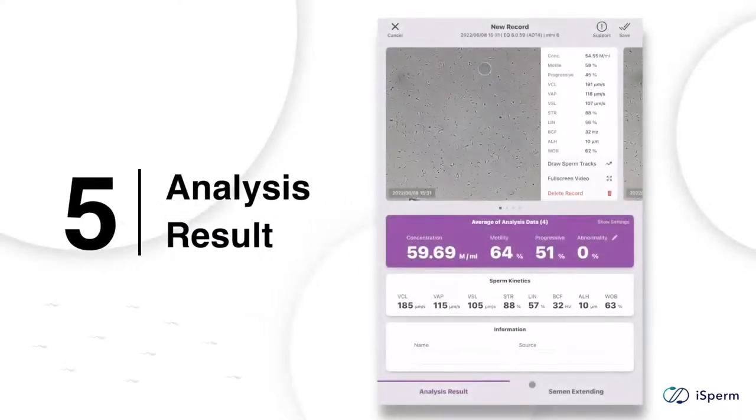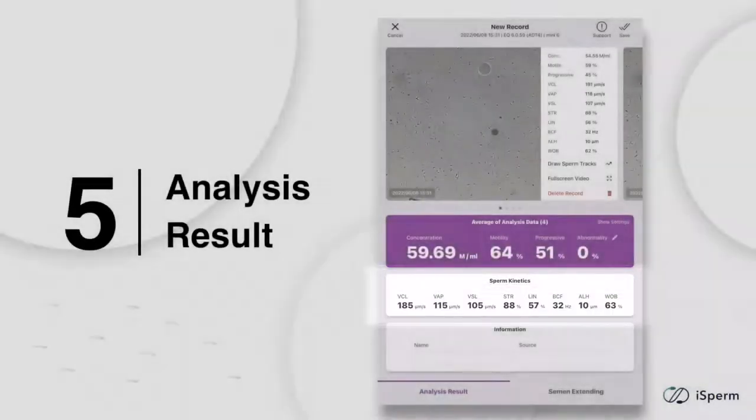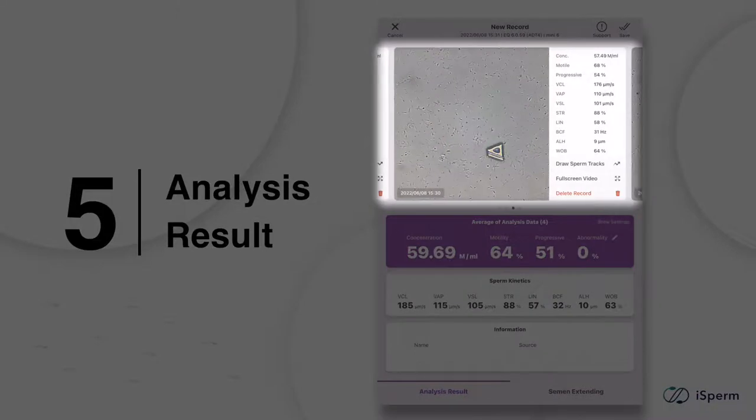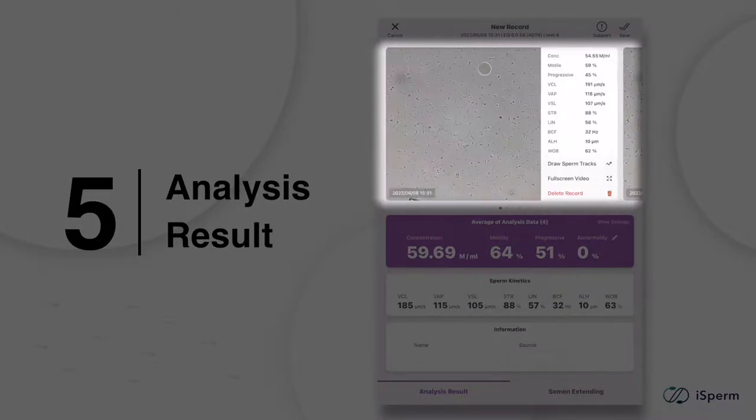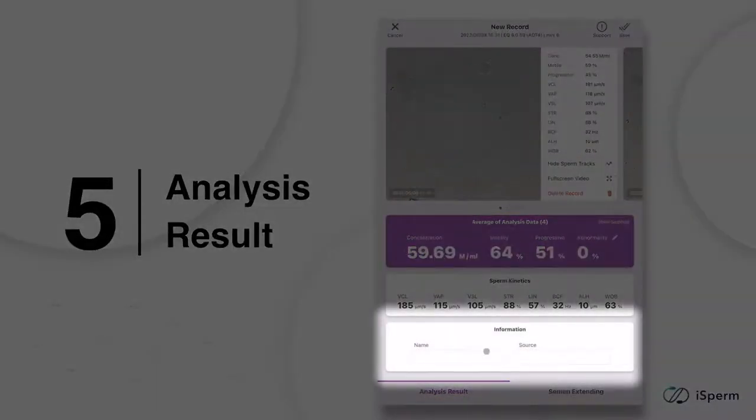On the final page you can find readings of concentration, motility, progressive motility, and other sperm kinetic parameters on average. You can review your videos and swipe left to check the data of all your takes. iSperm provides a featured function to visualize sperm swimming tracks — by tapping the 'Draw Sperm Tracks' button, the system labels sperm tracks using different colors, helping you distinguish progressively motile sperm from only motile ones. This is a great proof to show to your clients and sets up a common language for communication with colleagues.